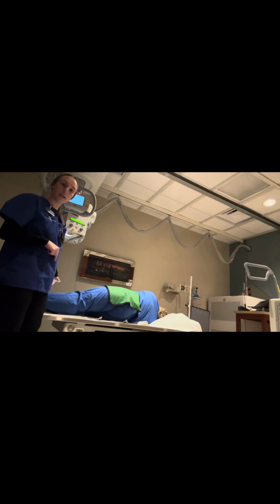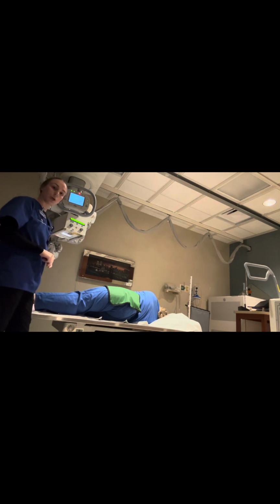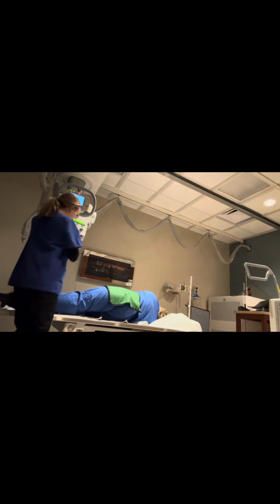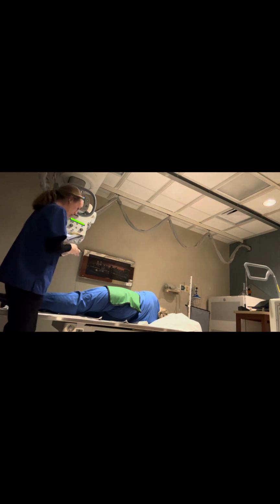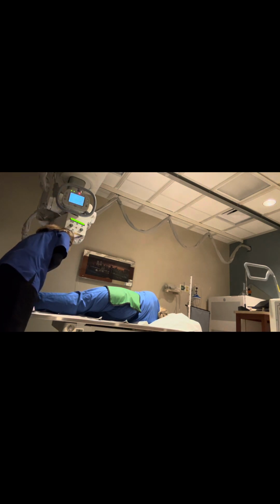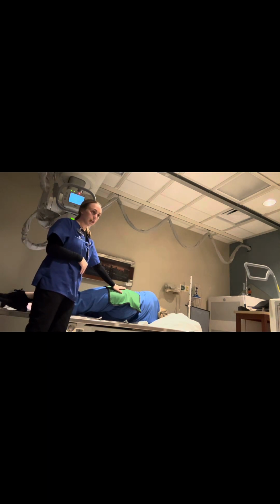To center at the mid-lower leg. And you also want to make sure that her left leg is in a true lateral, so the plane of the patella should be perpendicular to the IR. And you want to have collimation open again so that the knee and the ankle joint are included. And then you're going to put a left marker down. Make sure your shield is on the gonadal region for radiation protection again.